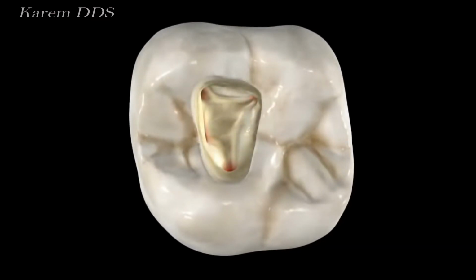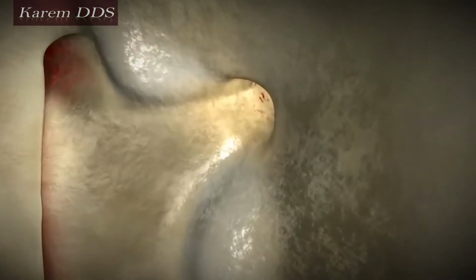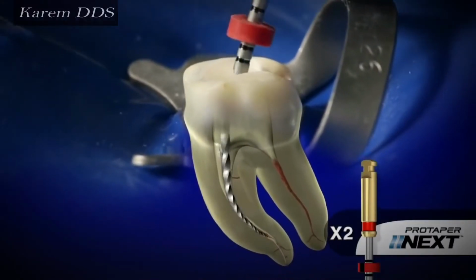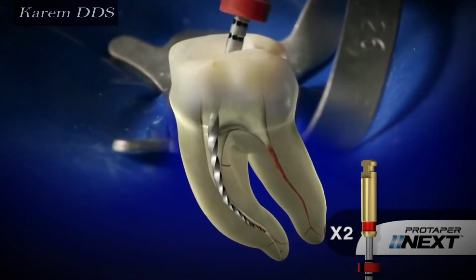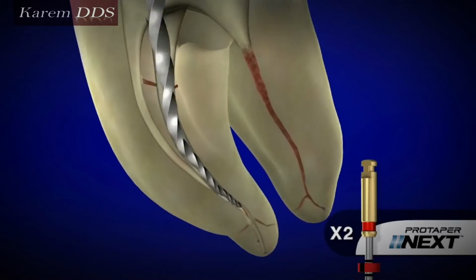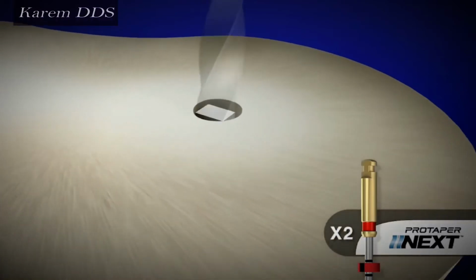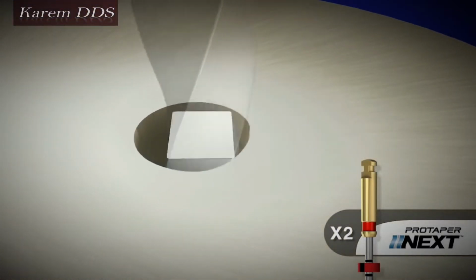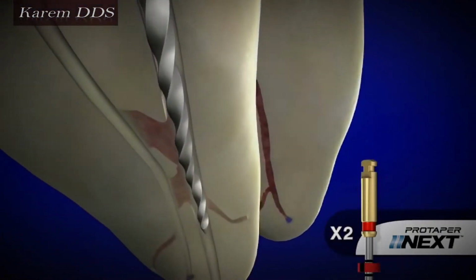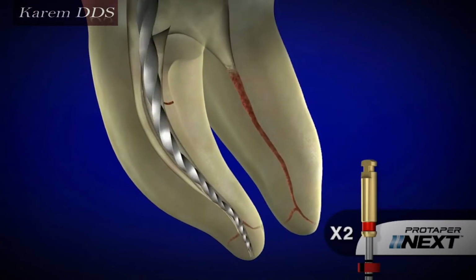The most significant factors affecting the instrumentation of teeth are tooth anatomy and morphology and the type of instruments and irrigants used for treatment. Instruments must contact the root canal tissues to debride the canal. However, it has been shown that most of the root canal surfaces are not touched by hand files or instruments, even with the best efforts of the dentists.